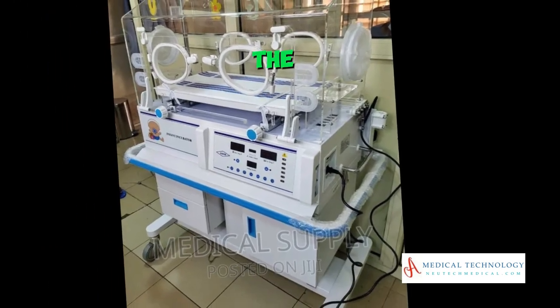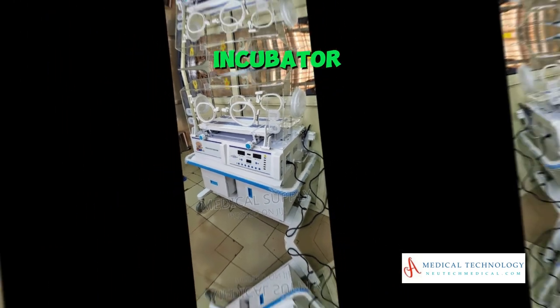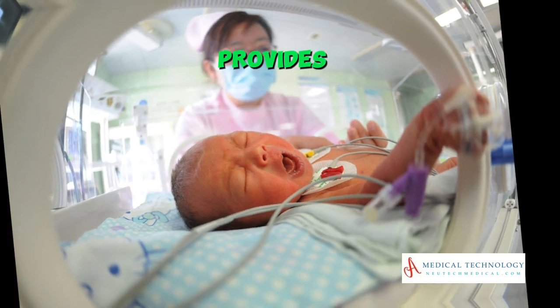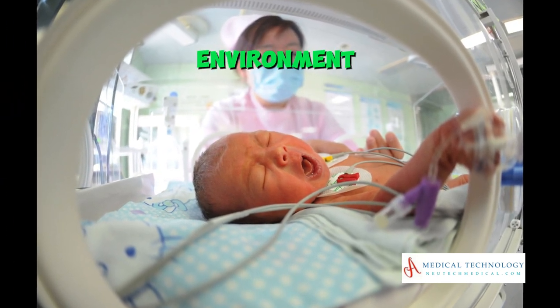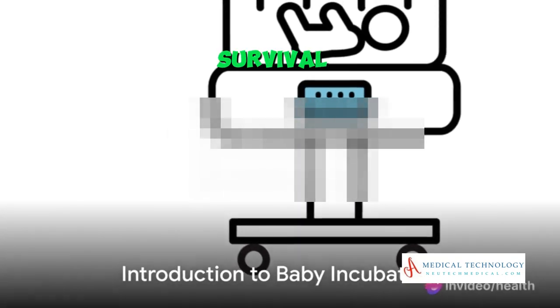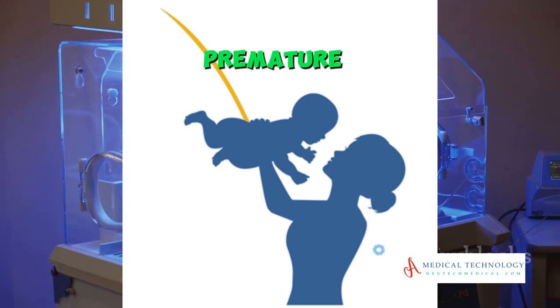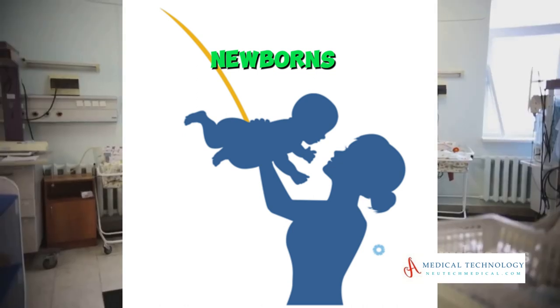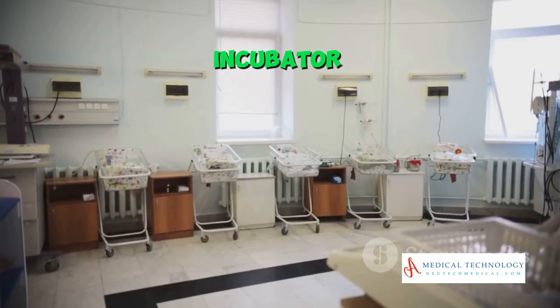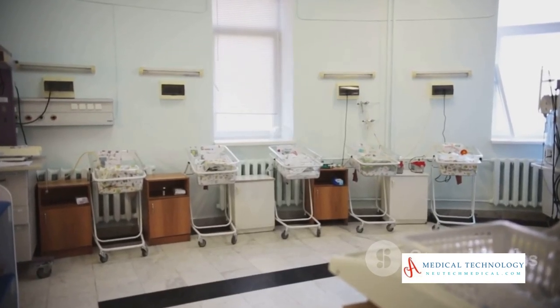The combination of these elements in a baby incubator provides a carefully controlled and monitored environment, optimizing the chances of survival and healthy development for premature or ill newborns.